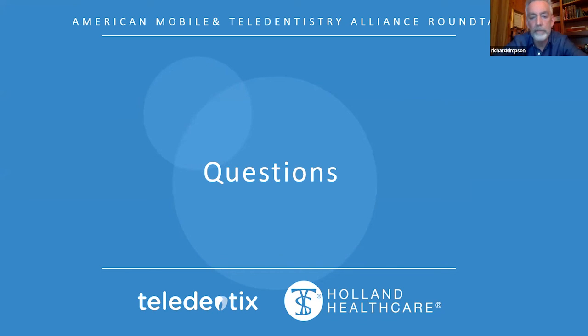So being able to provide that, I think, is a very comforting aspect of providing that care, giving them an image and saying, hey, this is what happened. This is going to be okay. This is how we recommend addressing it. And we wanted to get your permission to do that. I think that would be a tremendous advantage for people who can't make their own decisions as well.